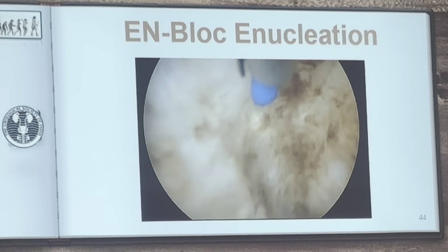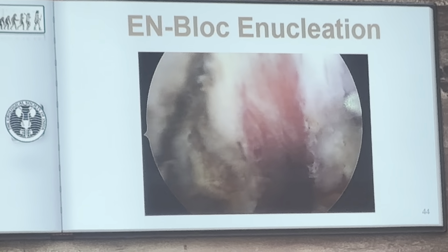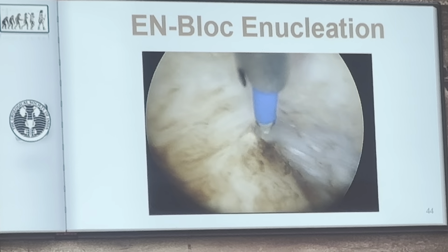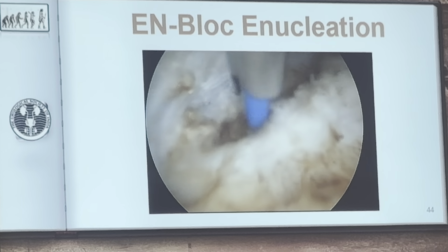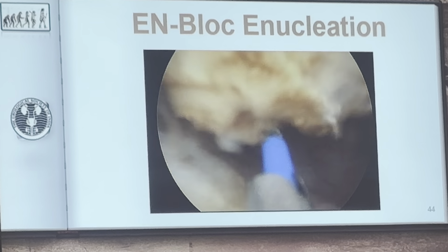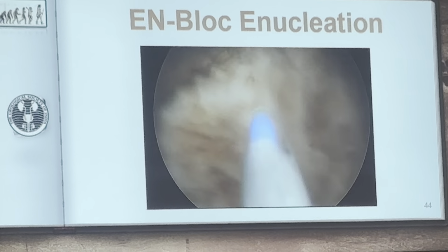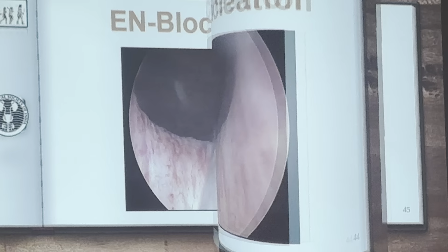Now this is the 12 o'clock incision, and this is the most important aspect. This is the apical tissue which we can cut very precisely and without any sphincteric injury. Once we do that, we match the incision on both sides and completely separate it from 12 o'clock. And lastly, these are a few attachments at the bladder neck. Once we take down the entire adenoma, like in a Freyer prostatectomy, the entire adenoma is in one piece. So there is no piecemeal kind of thing.